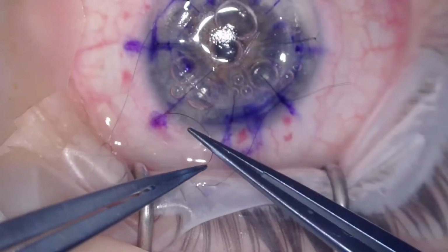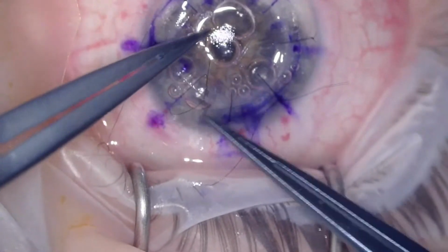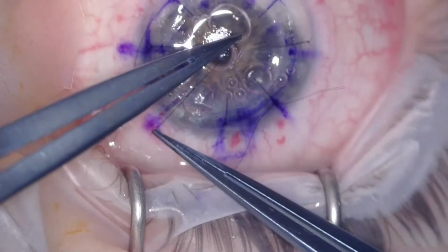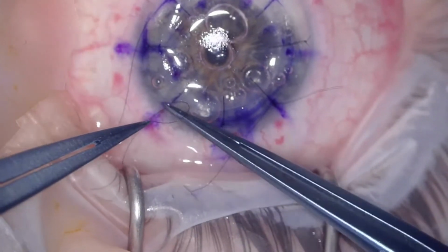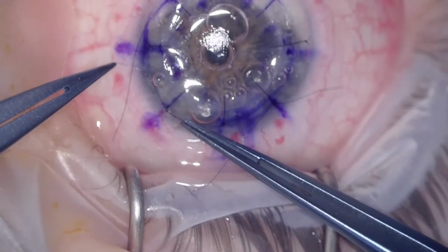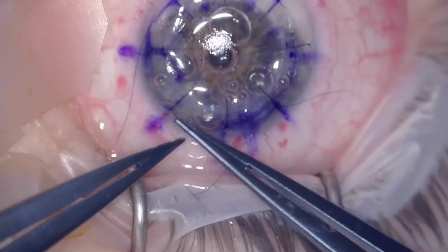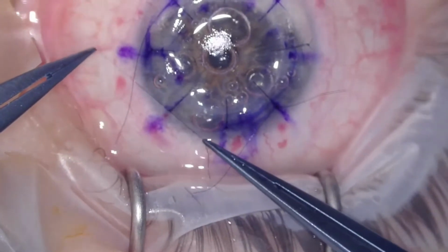Now I'm just tightening all the sutures. Again, I'm not going to show you tightening all the sutures, I'm just going to show you clips of this, and just as an overview of the fundamentals of doing suturing for DALKs. I do sometimes do continuous sutures for DALKs after having done interrupted, but again it varies depending on the type of graft I'm doing and also on the patient as well and the aftercare that's required.